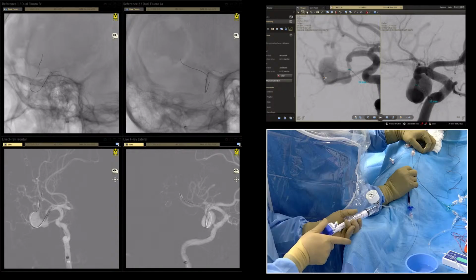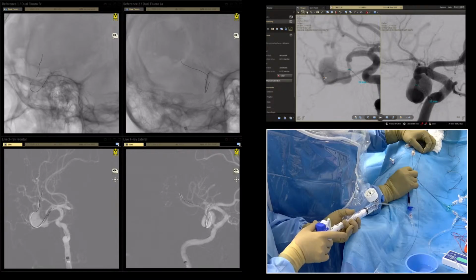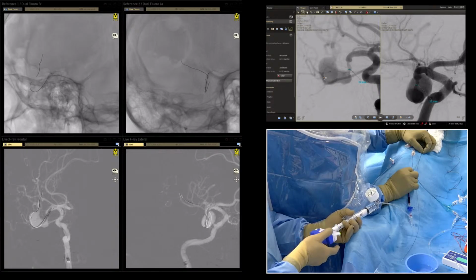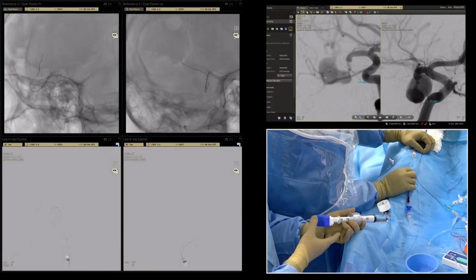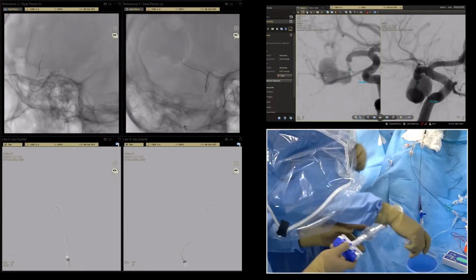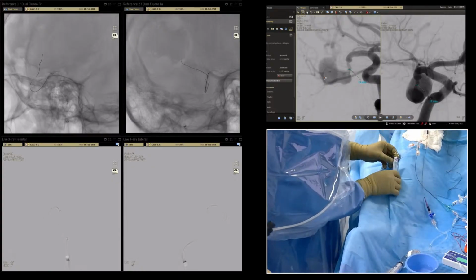6. 8. Вон. Сильно напрягается? Нет, не сильно. 12 бери. Вон. Okay, now we gave 12 atmospheres. We will leave. Подержи. Подожди.